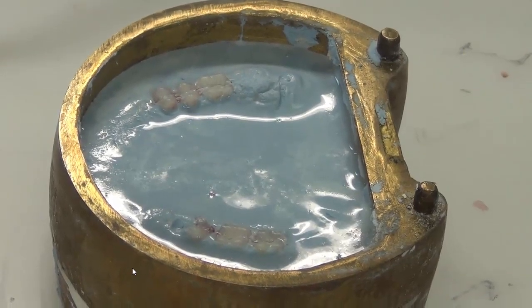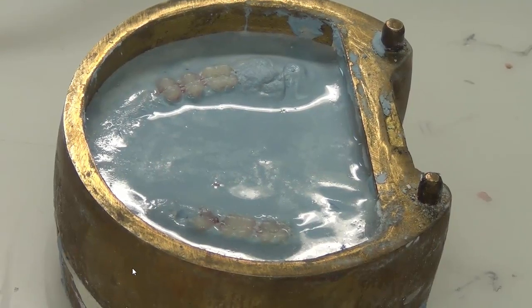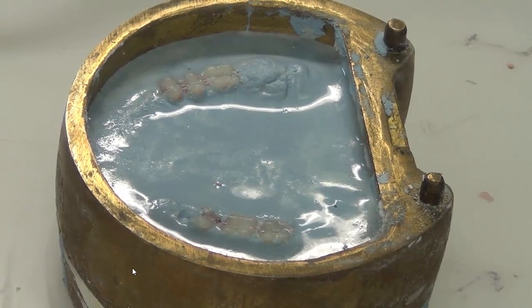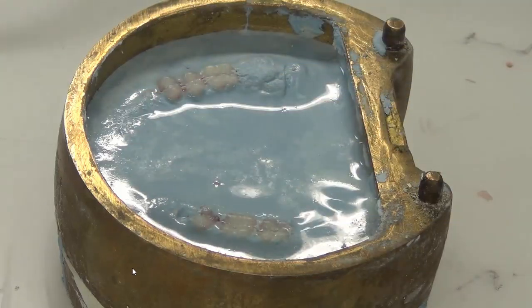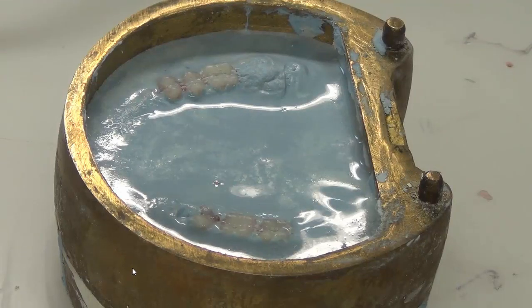The term improved stone was used in your first book when we were talking about dentures, but actually what is it? It's a bit stronger than the stone layer itself. It's a mixture of dye stone and stone, or purely dye stone. The function of this layer, which opposes the teeth between the teeth and the flask: once we pack acrylic later on, you will see the packing step, we don't want the teeth moving into the layers. So this layer will prevent the movement of the teeth better, so it will resist packing forces better.